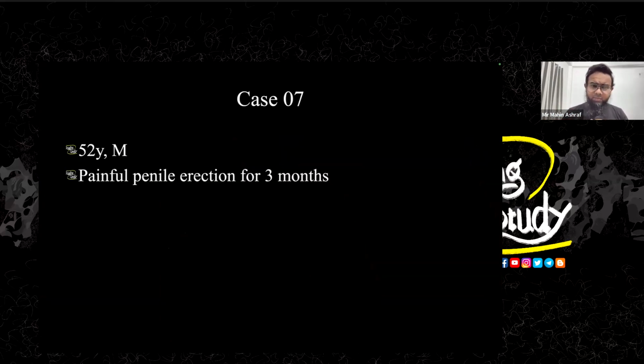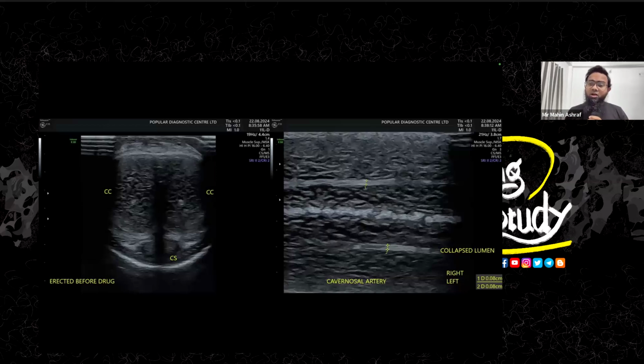Now case number 7. This is a 52-year-old male patient who came with painful penile erection for 3 months. I was amazed to know that it was 3 months. So he said, yes, 3 months. Painful erection for 3 months. We did an ultrasound scan before and after oral drugs. We used tadalafil. I don't know the trade name in your country, but we call it tadalafil.